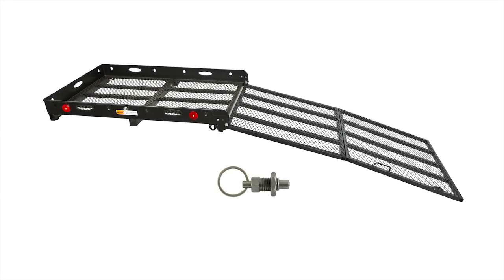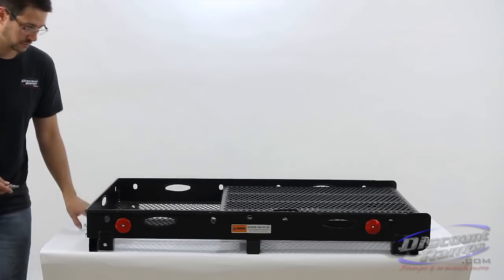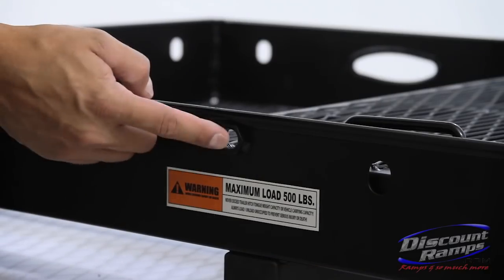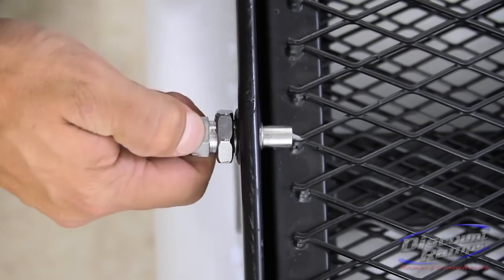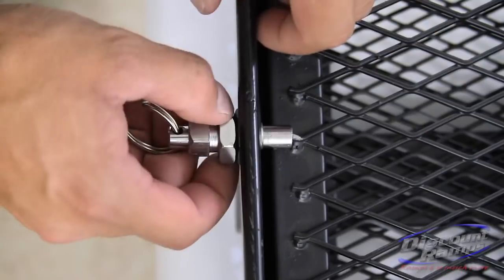Parts needed for step one include carrier and spring pull pin. To begin, install the spring pull pin into the front of the carrier basket. Adjust the spring pull pin with enough room that when pulled back, the ramp can be lifted out of the carrier basket. Secure in place with jam nut.